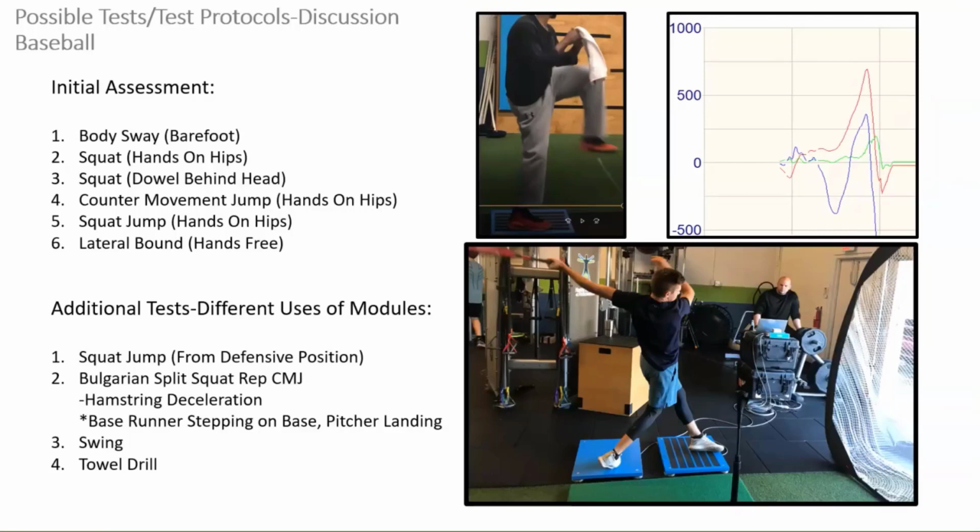Due to the short amount of time, I had to cut this presentation down a little bit. There's a lot more information I have. I've worked with over thousands of athletes and I have 9,000 or so readings just with the Mars, and then even more with the BioWare on different things.